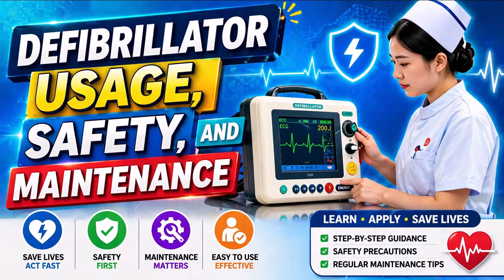Defibrillators are commonly used in emergency departments, intensive care units, operating rooms, and even public spaces. There are several types of defibrillators used in healthcare settings. The most basic type is the manual defibrillator, which requires trained medical personnel to interpret the electrocardiogram, or ECG, and decide when to deliver a shock.